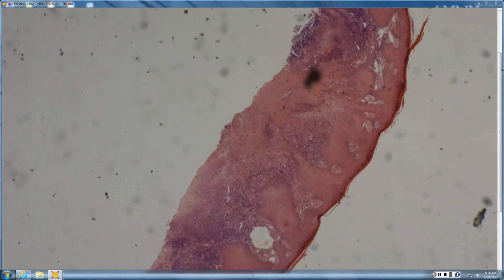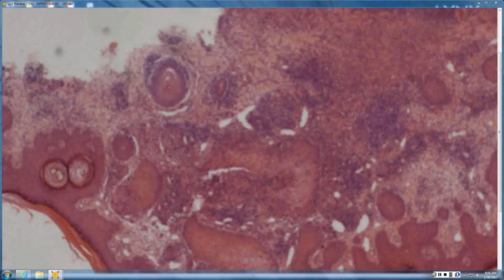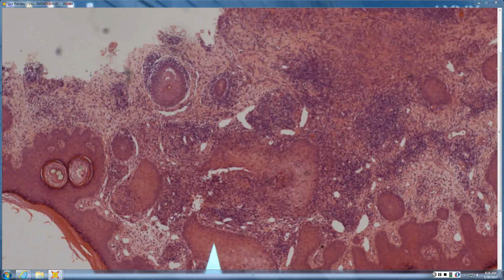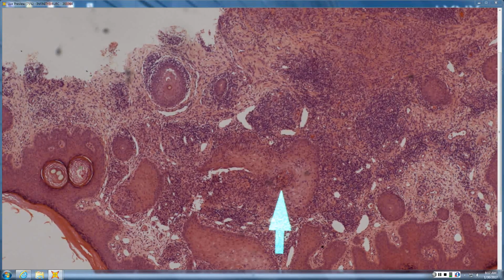All right. So it looks like a busy deep dermis, with just a mildly acanthotic epidermis. Is it mildly acanthotic, or is it a little more than that? I guess it's a little more than that, maybe to the point of PEH, pseudoepitheliomatous hyperplasia. And then what's this cluster of things that look like ants? Pus, neutrophils. Do you have a differential for PEH with pus?